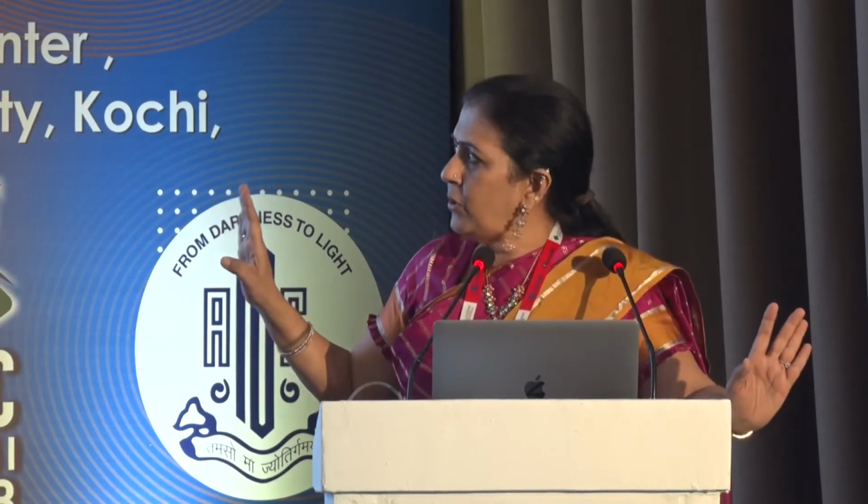Yeah, I made my side port, I've injected the dye. I start my rhexis, but I find that I don't have that kind of tactile stimulus which is there if the capsule was not lax. So I very slowly start the rhexis, but then I actually enlarge it also because I feel that it was fine. It wasn't that I was having too much difficulty, but I decided that I'm going to place capsular hooks. I want the capsular bag to be quite stable. I'm not going to take chances, but I'm not sure about the zonular dialysis.